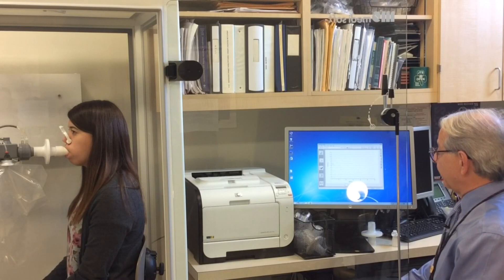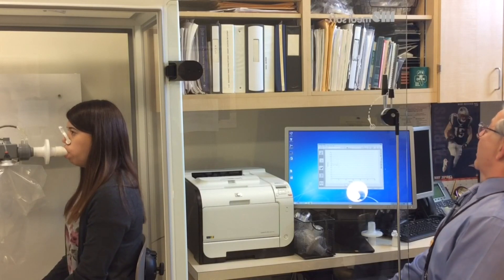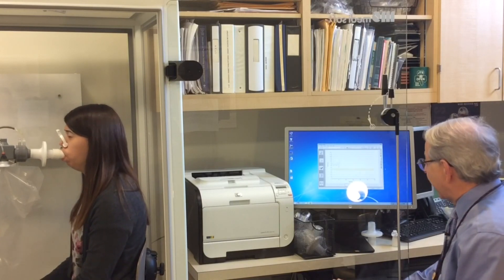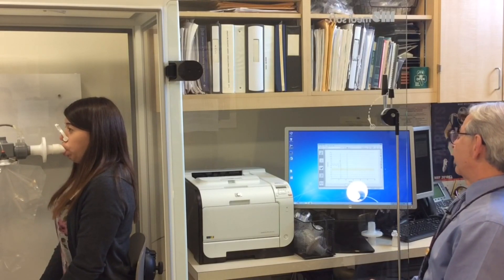Just going to take a couple of easy resting breaths. I'll have you do one more. Breathe in. Now blow it all out. Squeeze it out. Now big breath in. Quickly, quickly, quickly. Hold your breath. Good job. Hold your breath.